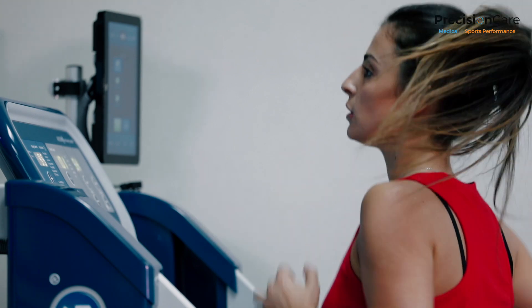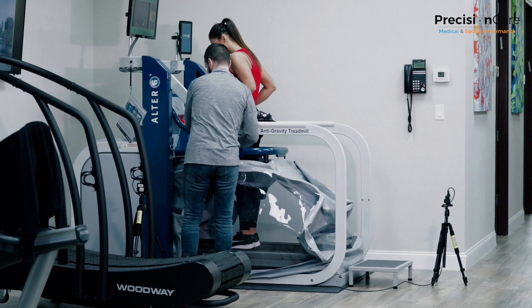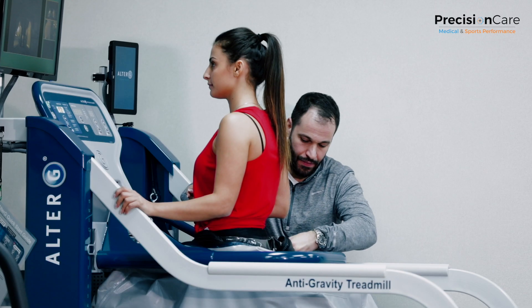Earlier we had a patient running on the treadmill. Our patient sustained a knee injury where she tore her meniscus. She's an avid runner — she runs marathons — and it was important for her to continue training while she's injured.